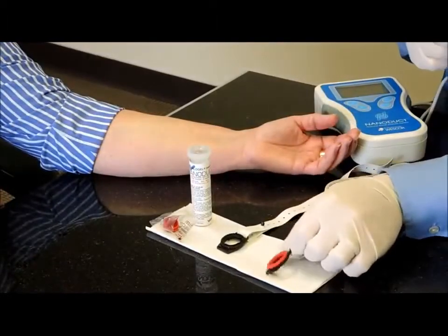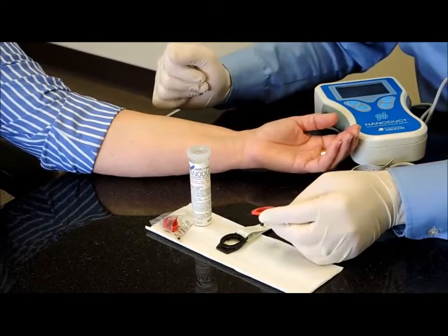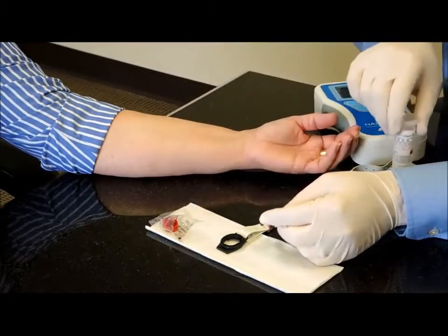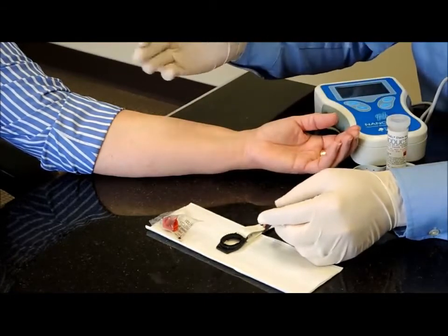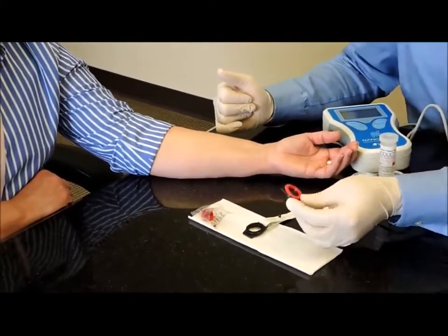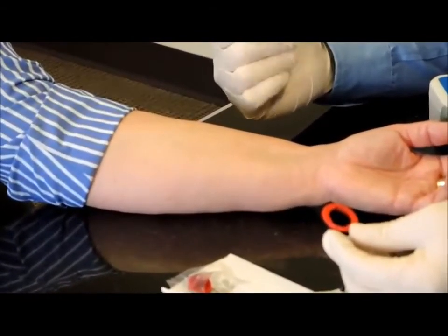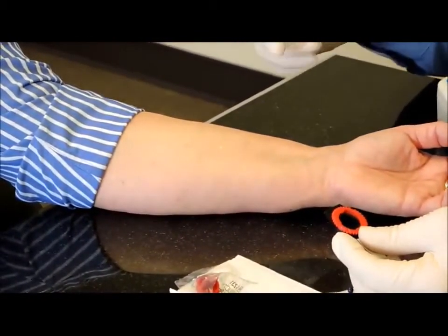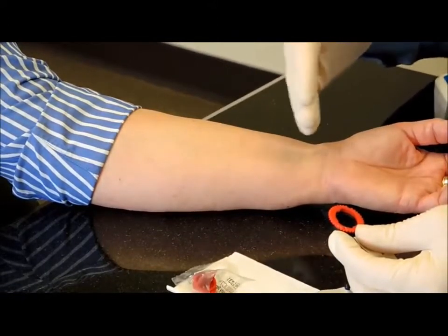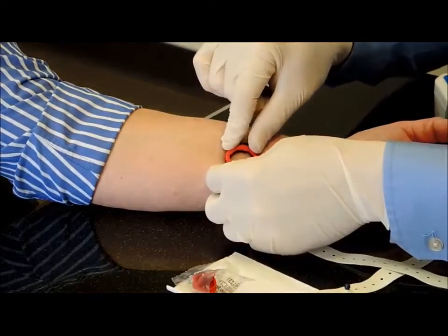Before we apply the straps, we want to find a good location on the arm that doesn't have any obvious cuts or abrasions, and good healthy skin. We like to have the red holder, and thus the red electrode, that's where the sweat will be produced, as close to the wrist as possible, the forearm area. And so there's a good area right here.